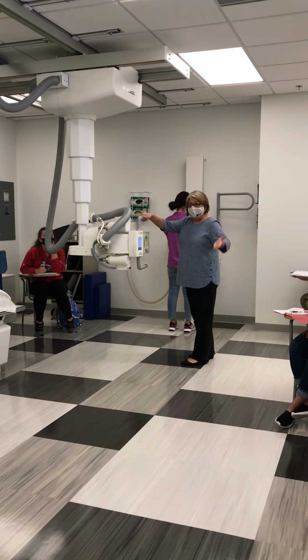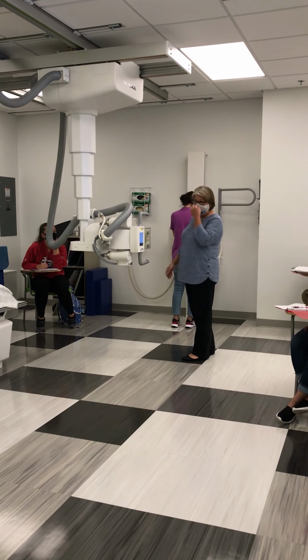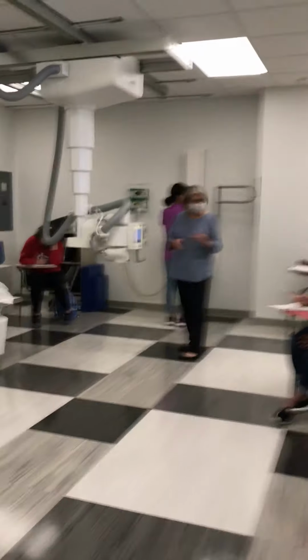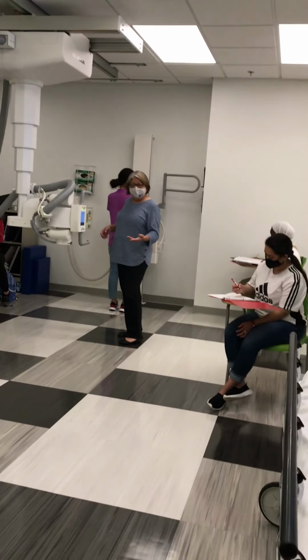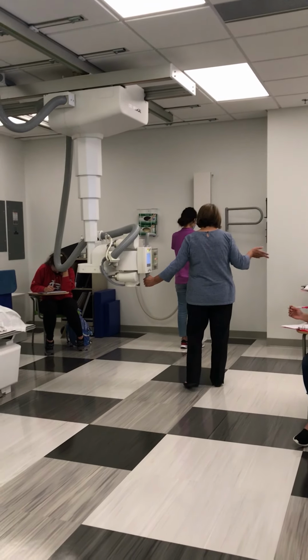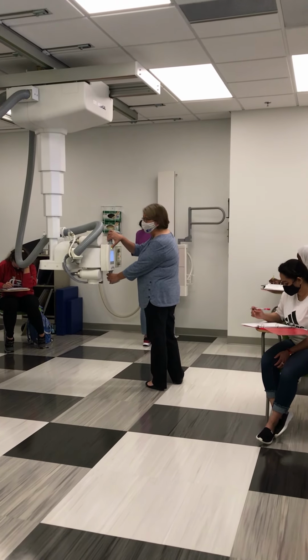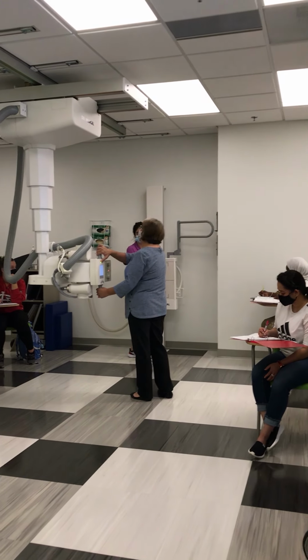That distance is called the SID, source to image receptor distance, and that's on your simulation guides. So for our chest exam, our SID is 72 inches. For every chest exam, your SID is 72 inches.